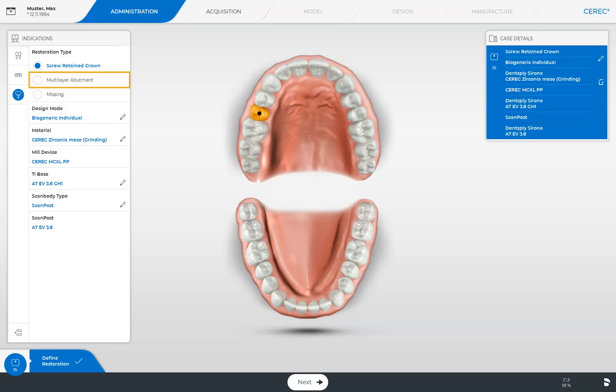In the case of a multi-layer restoration, you first determine the design mode, the implant manufacturer, and the implant type, just like before. However, the material needs to be selected once for the implant abutment and once for the crown. Apart from this, the procedure in the administration phase is identical.